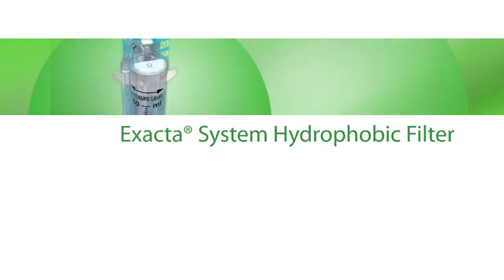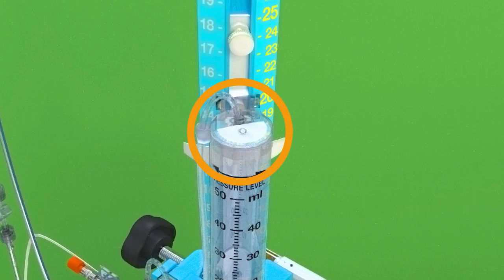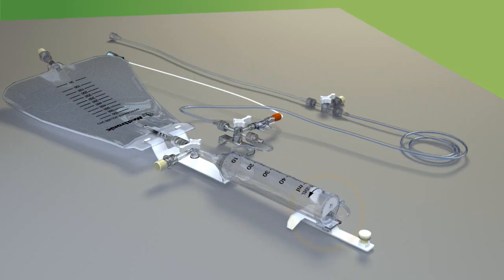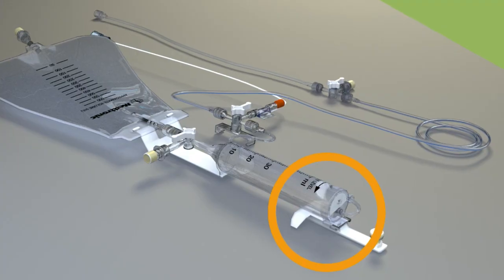The Xacta System Hydrophobic Filter. The Xacta drainage system is designed with a hydrophobic antimicrobial air vent. If it gets wet, the system will still vent properly. As a result, the filter will not clog if it comes in contact with fluid when the system is laid in a horizontal position.